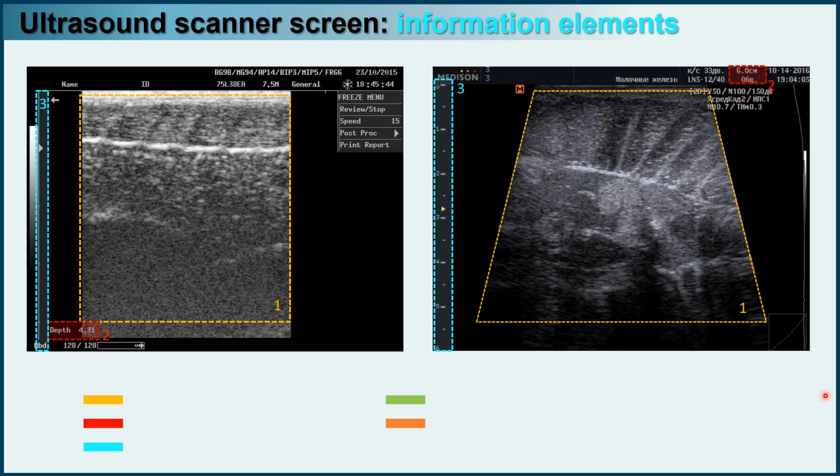Next, the echogenicity scale allows you to understand the degree of echogenicity of the tissue based on the current scanner settings. Echogenicity characterizes tissue by the degree of reflection or absorption of ultrasound. This is an important characteristic, especially when identifying sex at certain stages and assessing the degree of maturity of fish. And the echogenicity scale allows you to understand how the areas that completely reflect sound, completely absorb it, or have moderate echogenicity look at the current settings.